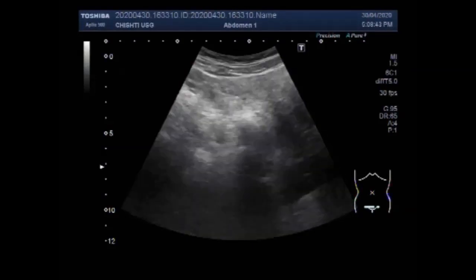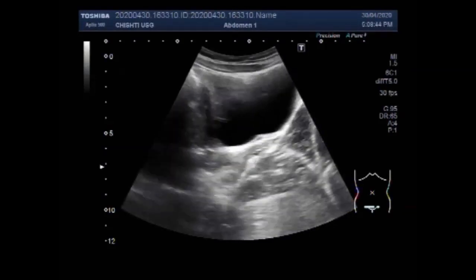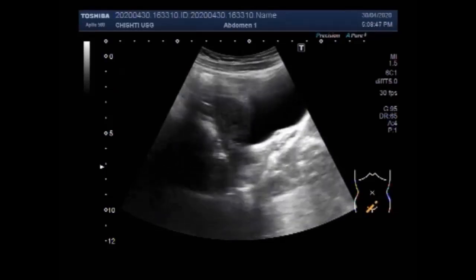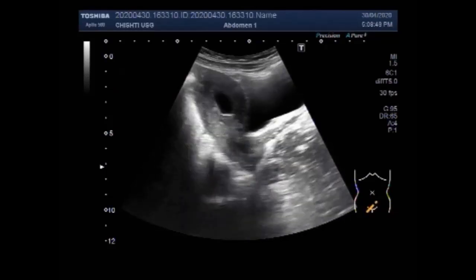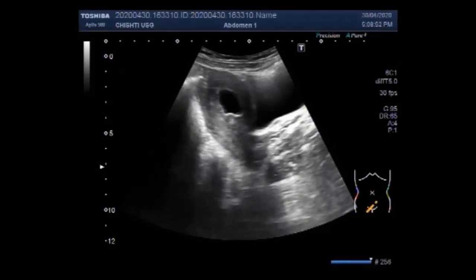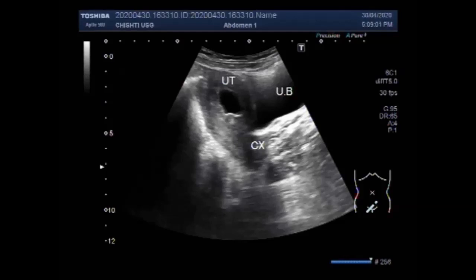Dear viewers, I hope you are all fine. This ultrasound video shows an empty gestational sac in a pregnancy of about six weeks, two days. You can see the urinary bladder, uterus, cervix and the empty gestational sac.